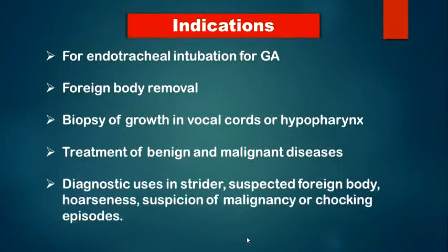It is also used in diagnostic cases of stridor, hoarseness of the voice, suspicion of malignancy, or choking episodes. Some of these indications are surgical, not related to us, but we use the laryngoscope as a neonatologist or pediatrician in neonatal resuscitation, and even in the neonatal and pediatric intensive care unit. We put the endotracheal tube for the patients to connect them to ventilators. So this is our job, to make the intubation by using the laryngoscope.